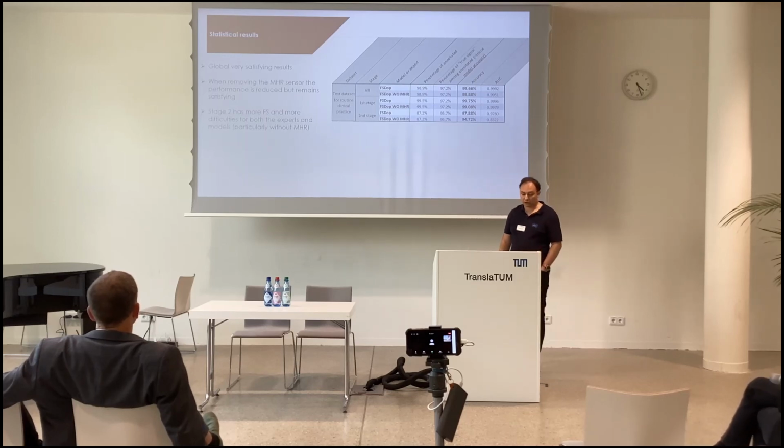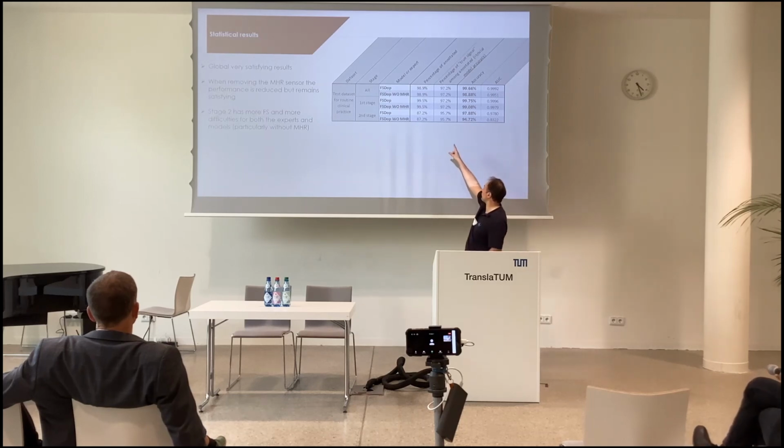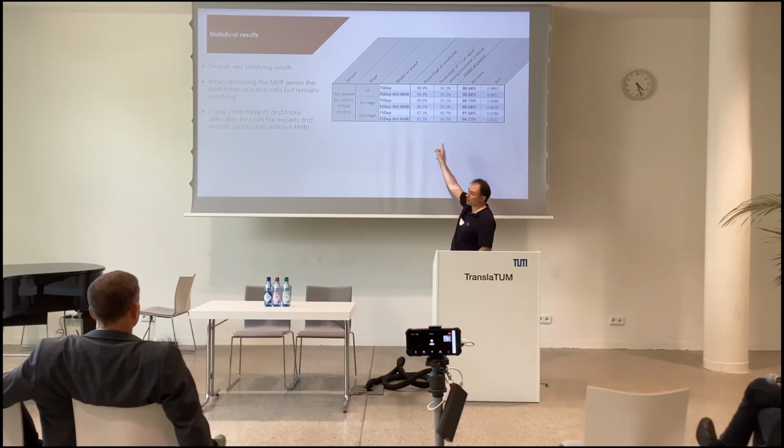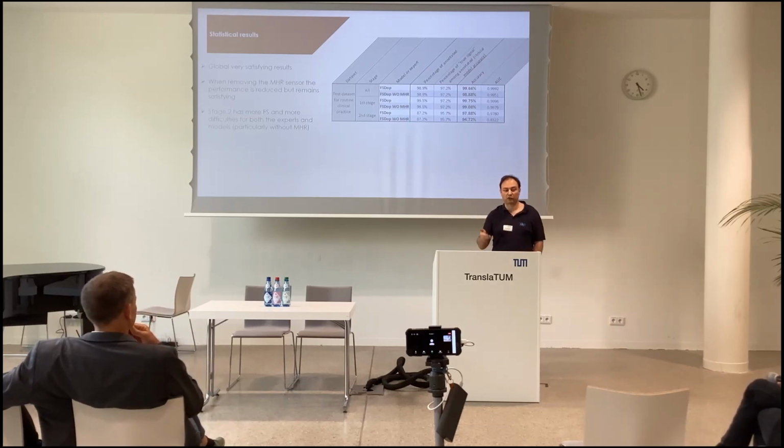And if we look between the first stage and the second stage, we can see that the second stage has many more false signals, and also that the experts were unsure for 10% of signals, so even the experts have a lot more difficulty analyzing the second stage of delivery.